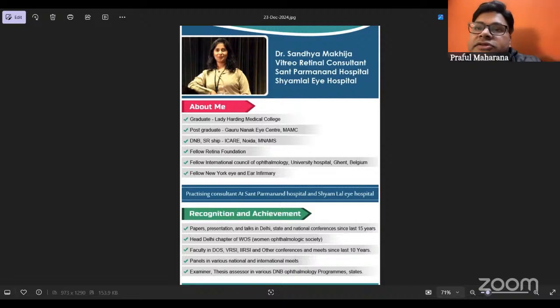Good evening, everyone. So we are back with another class of retina module, and this is a very important class for all of you because not only is this important for your day-to-day practice, but also from an exam perspective. In exam in Grand Viva, they may give you some images and ask you to interpret them. So this is going to be a very important lecture, ultrasound in retinal diagnostics, and for today's lecture, we have Dr. Sandhya Makhija ma'am with us.